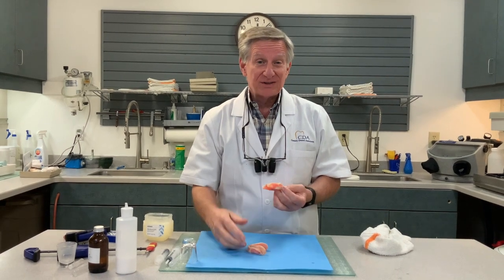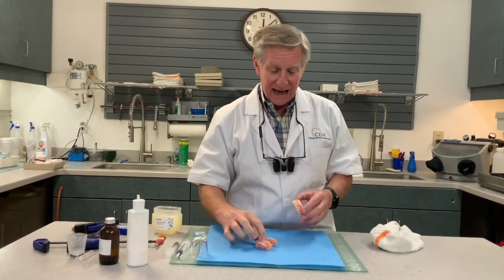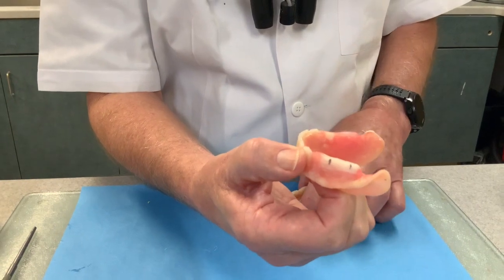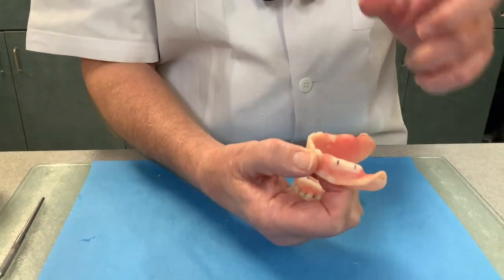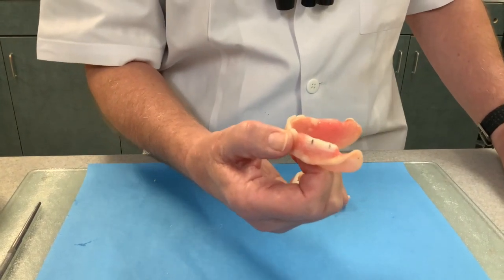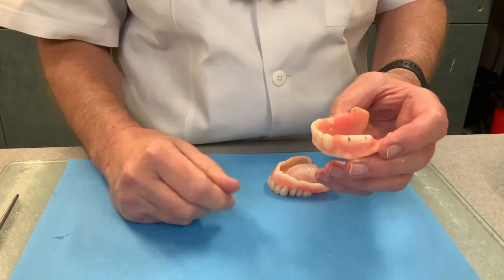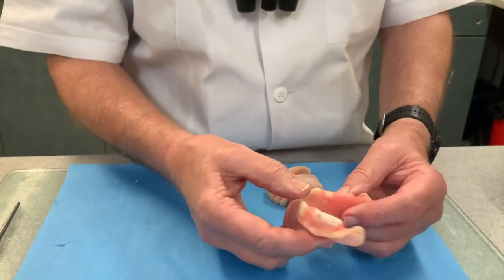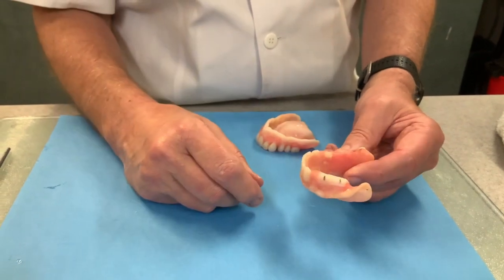Kathy brought me Miss Reed's provisional denture. She's been wearing this provisional for several months because she got sick while we were fabricating it. We also made a lot of changes — we actually moved the anterior teeth and changed the bite block. You can see I added tooth-colored material. This is what's great about a bite block: it allows you to change that vertical dimension upper or lower, or move it buccolingually. Miss Reed's number one concern was she was biting her tongue. We realized we had the teeth too far back and the bite block too far to the lingual, so we moved the teeth out and the bite block to the buccal. On this side we didn't really have to modify the bite block much, but the bicuspids are totally encapsulated with pink acrylic because we added it in. She's comfortable and doing great.